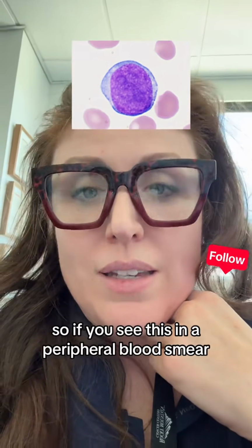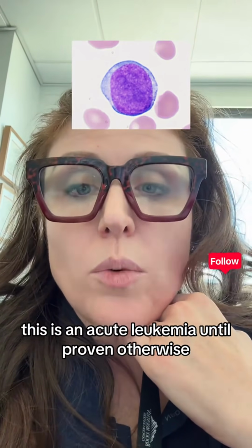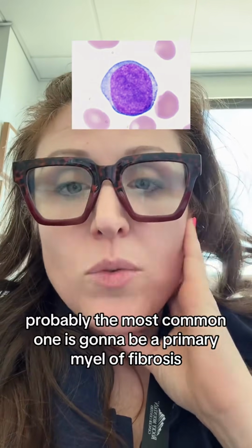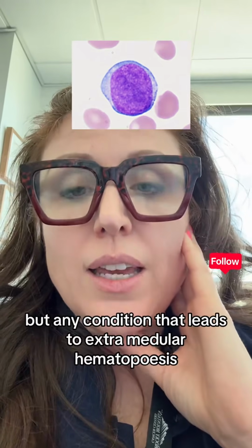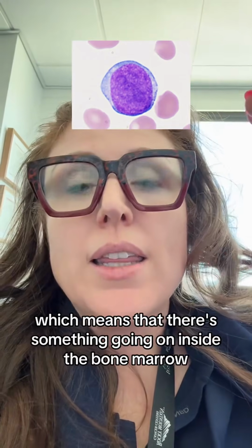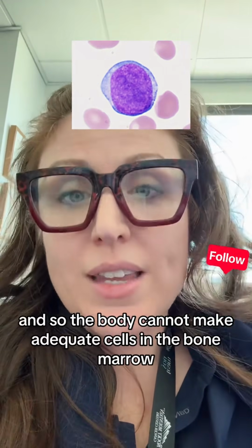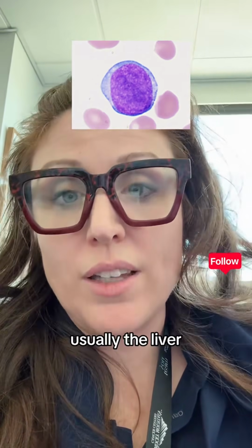So if you see this in a peripheral blood smear, this is an acute leukemia until proven otherwise. Now, we can see peripheral circulating blasts in other situations. Probably the most common one is going to be a primary myelofibrosis, but any condition that leads to extramedullary hematopoiesis, which means that there's something going on inside the bone marrow, and so the body cannot make adequate cells in the bone marrow, and so the body starts to produce blood in other organs, usually the liver.